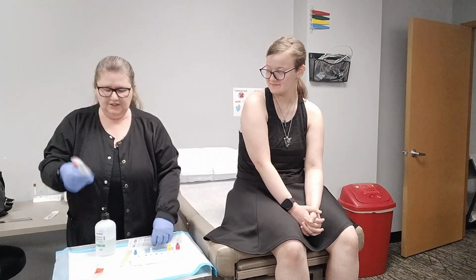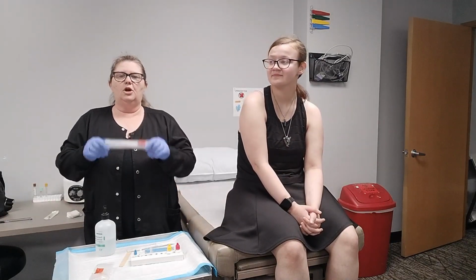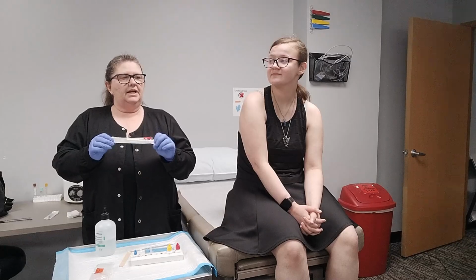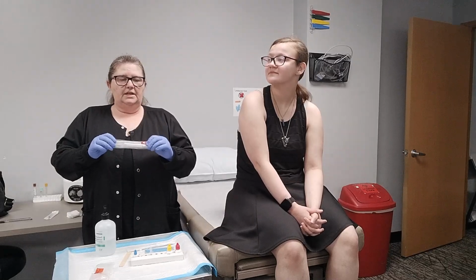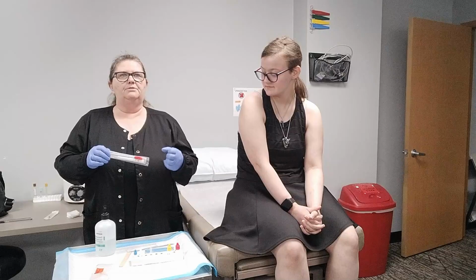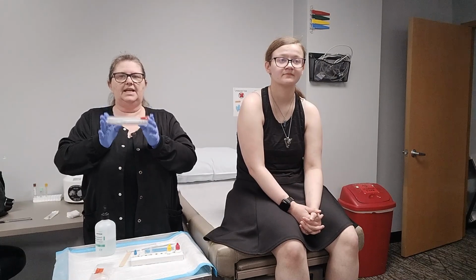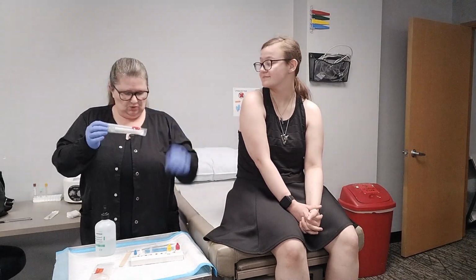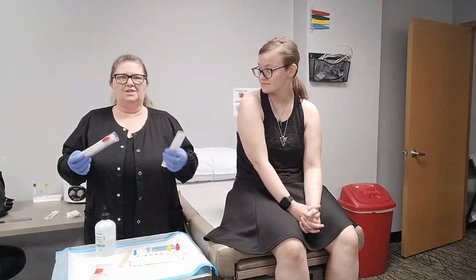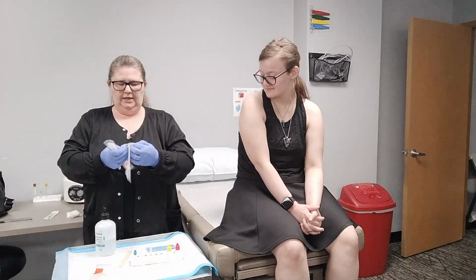Now, this is a transport swab, and I am going to go ahead and use it this time. You don't always have to use this, but the reason we would use a transport swab in this instance is if, for some reason, these results come back and the provider is not real happy with them, doesn't agree with them, wants to go ahead and send a culture off to the lab. This is what we would have to send. So what I usually do is take this swab and this swab and do it at the same time so I don't have to swab my patient's throat twice because it's not really comfortable. Okay? All right. So we're going to go ahead and get both of those out.